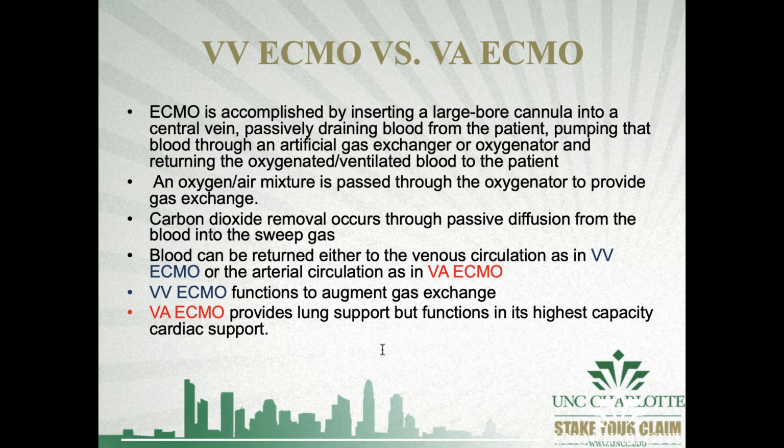Generally, when people are placed on ECMO, you have a sweep to flow ratio of 1:1. So if you have someone on a flow of 4 liters per minute, we're going to generally have our sweep at 4 as initial settings, like we do on the ventilator. And that means that we're going to look at our ABG, see what our CO2 is doing, and adjust our sweep accordingly. Depending on your protocol, you can adjust the sweep in increments of a half a liter, or even with the pediatrics, a quarter of a liter.